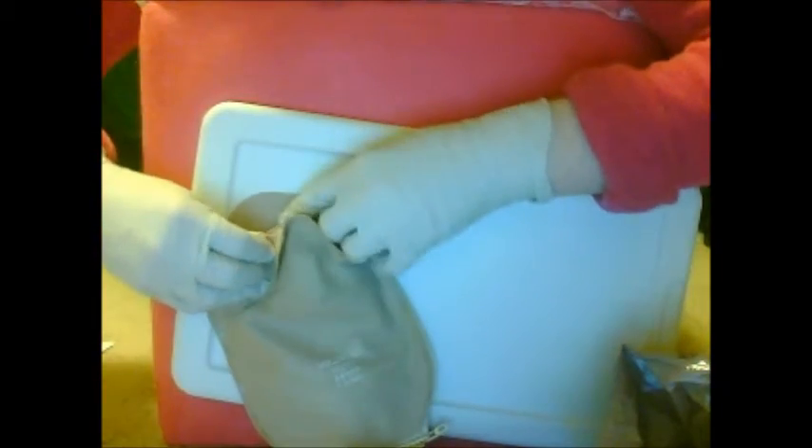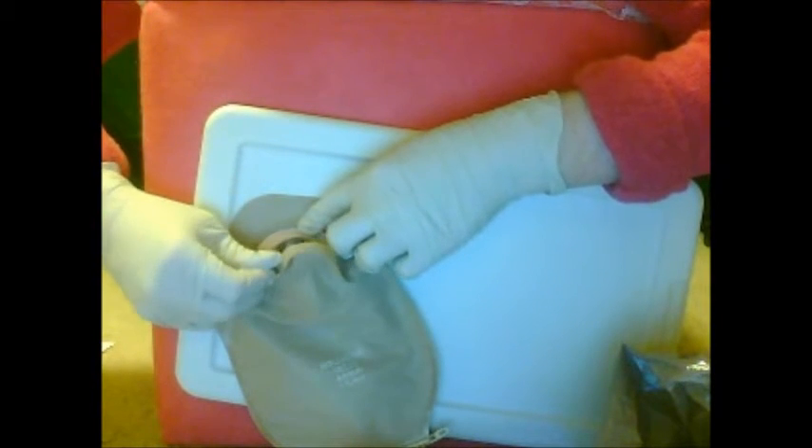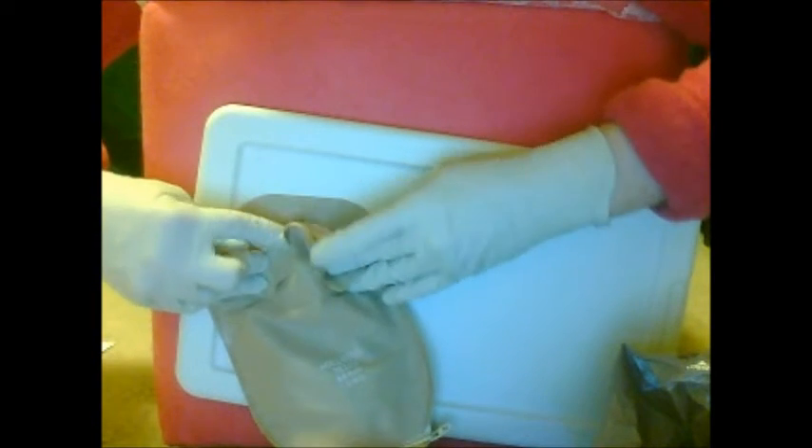Now I'll show you — sometimes the pouch fills up with gas, so you can just open the top a little bit, keep a hold of the bottom, and you'll just open it kind of like Tupperware. Then you snap it closed and you're good to go again.